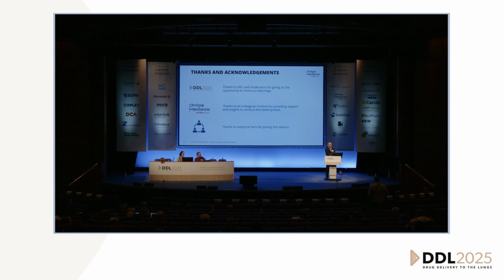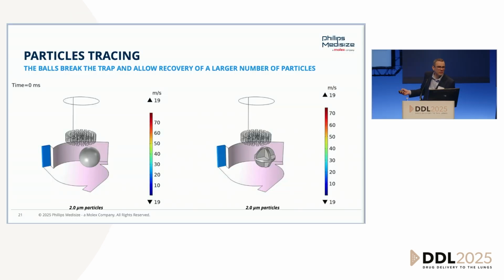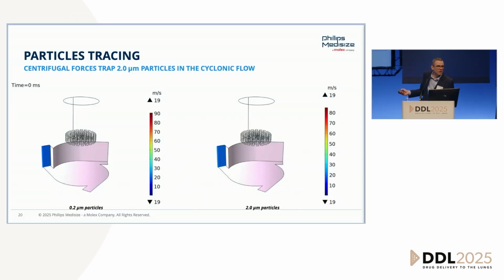Thanks. Great talk. I'm interested. It looked as though you might have slowed the plume down in terms of prolonging its timing compared with the no ball. I'm talking about the timing of the plume, the speed at which it comes out, the length at which it's extended, because that's often an interesting aspect that's not picked up in vitro, but has a huge impact on the pharmacokinetics.